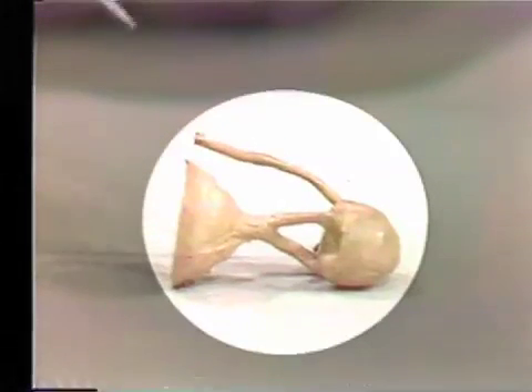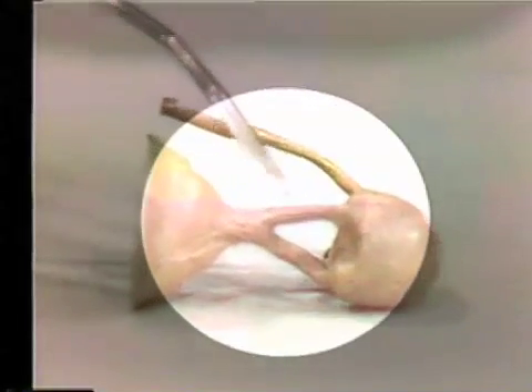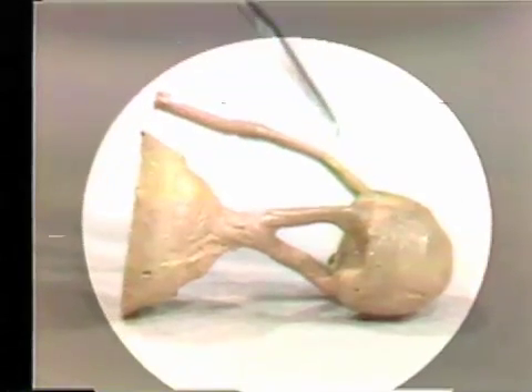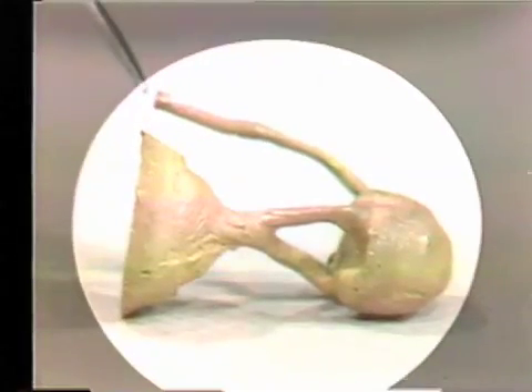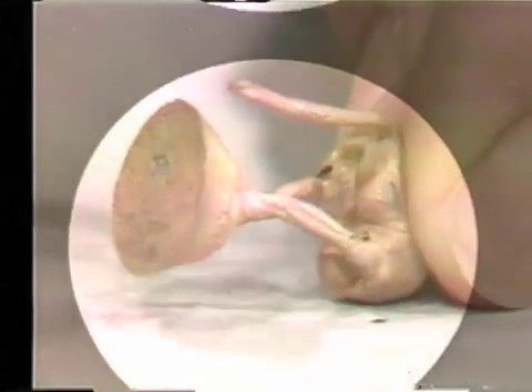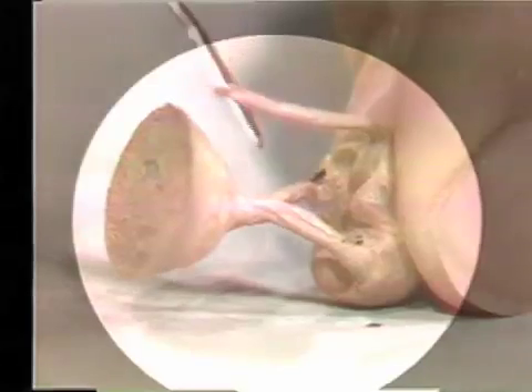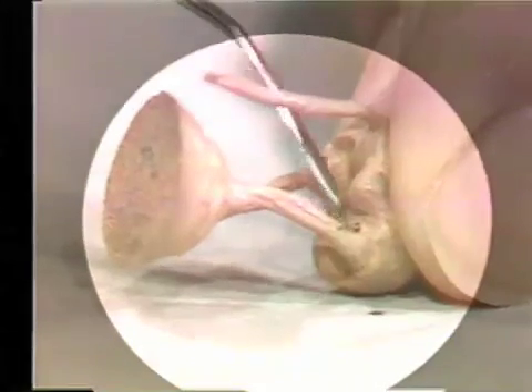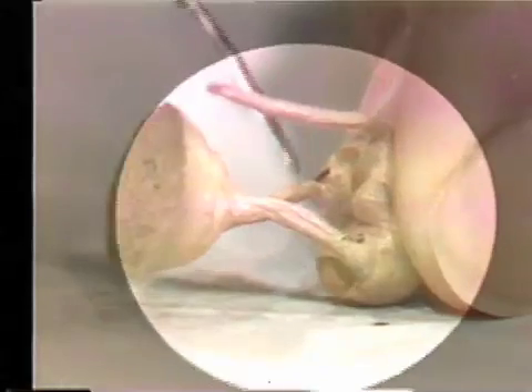The molten metal goes through the sprues right into the cavity, and the excess gases come out the other side. However, this has not done the job either. The surface is not as good — maybe a little bit better than the previous one, but you can see some poor surfaces that have not been filled properly.